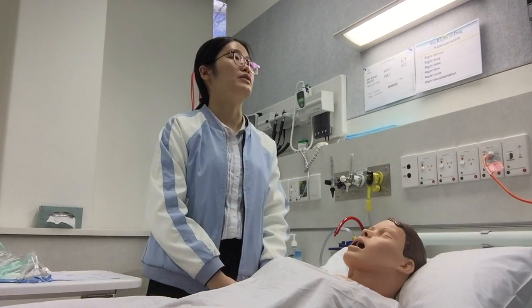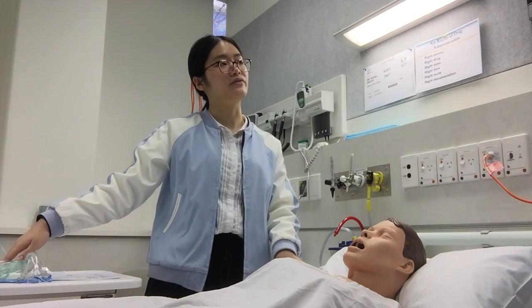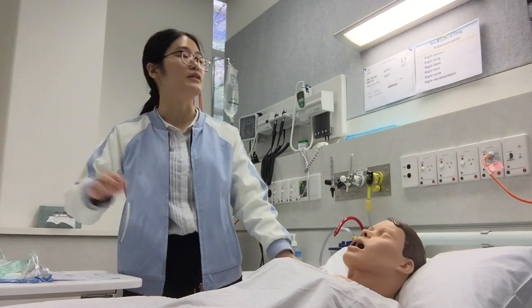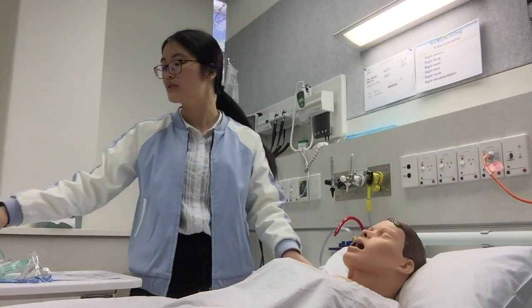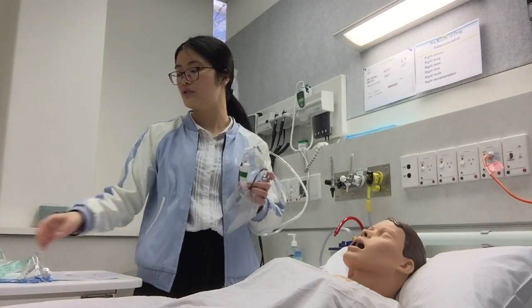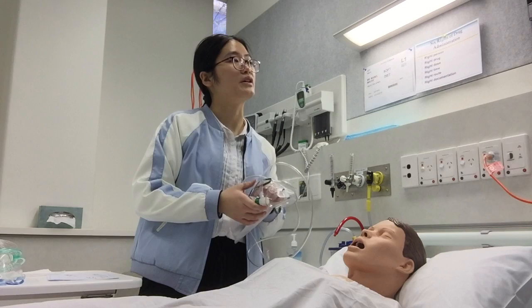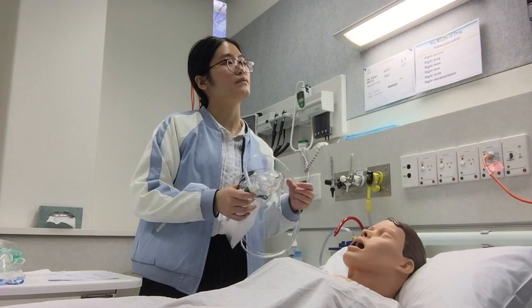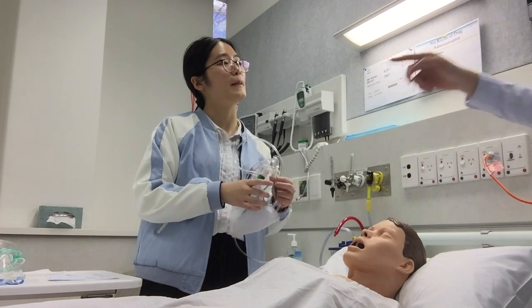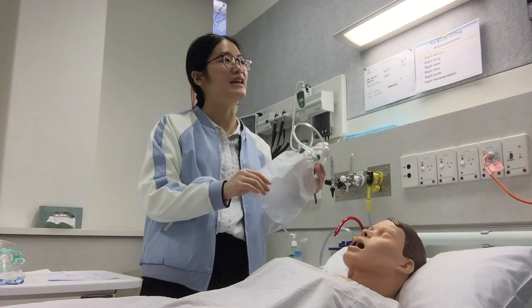Another question I want to ask you is, do you want to conclude the differences between the several devices? How do you think about in which situation you need to use the partial rebreather, and in which situation you need to use a simple mask? It usually depends on the person's situation, right? I think in the ward we usually use the nasal cannula. Yeah. I think that one should be used in the emergency.